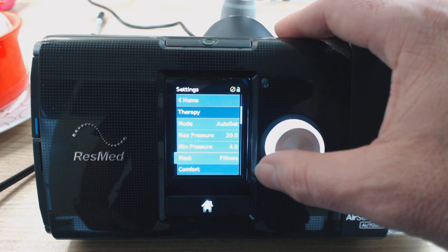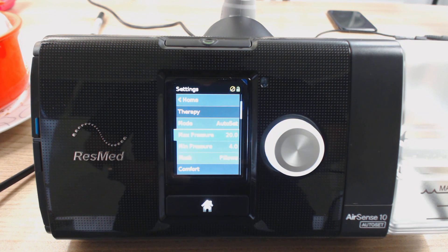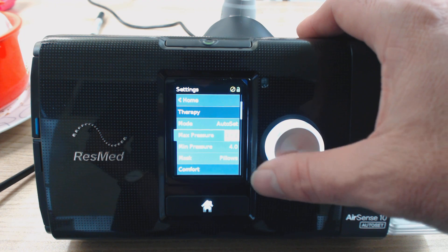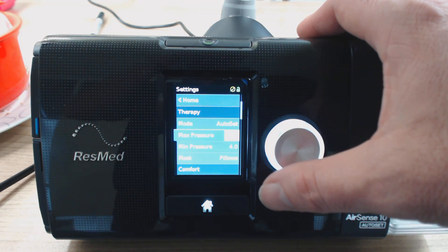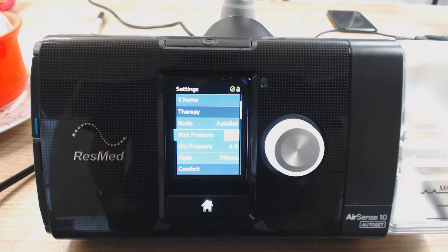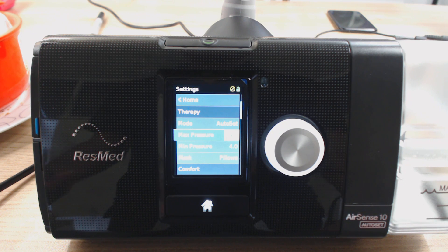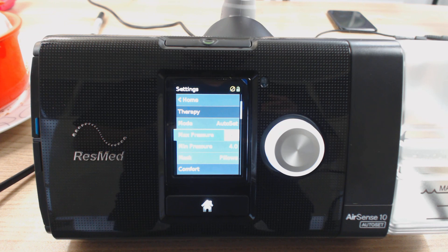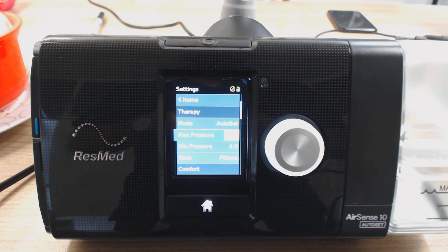Or if the pressure is just getting too high at nighttime — it's too intense and it's waking you up — then you can use the data to bring down your max pressure to a point that's more comfortable and still maintain a good apnea-hypopnea index. What that's going to do is cap the auto algorithm so it can't go above that value. There might be a period of the night where it's just getting too strong, but it's no good if it's going to constantly wake you up, cause mask leaks, or wake up your partner. It's about getting that nice fine balance between good therapy and good sleep comfort.